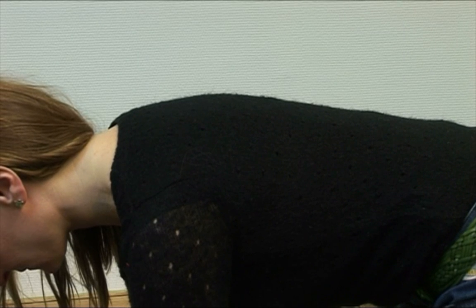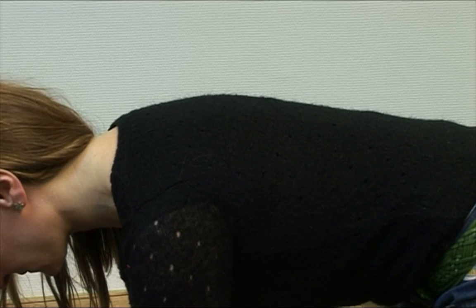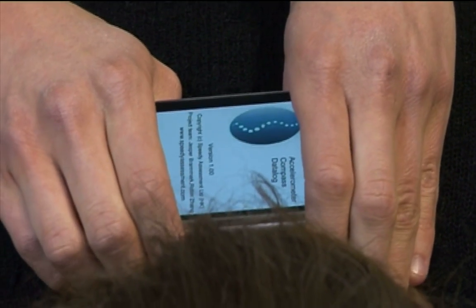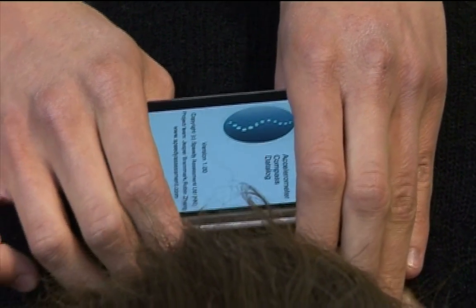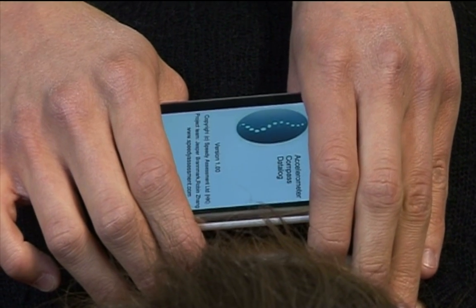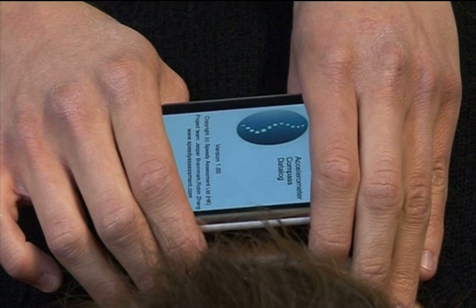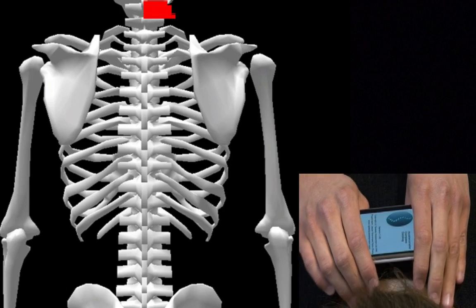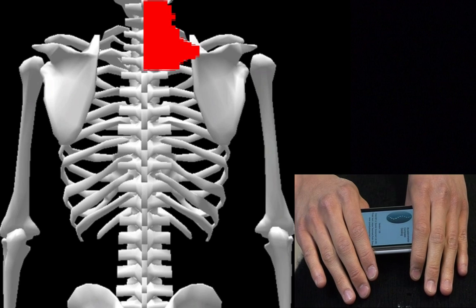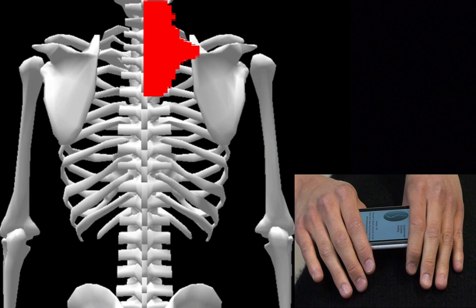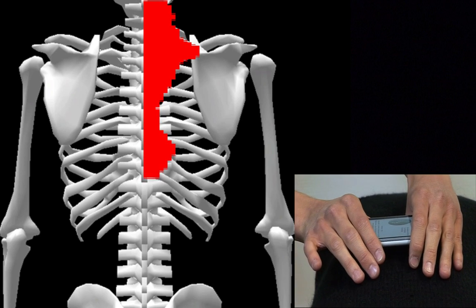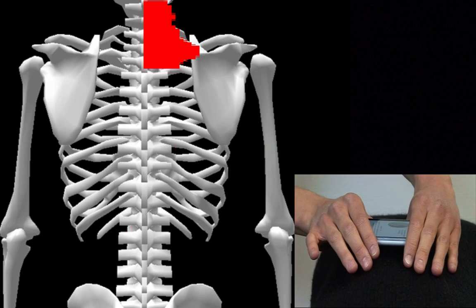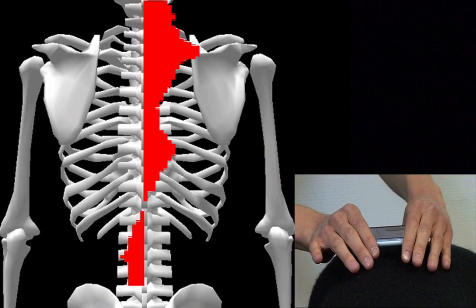Now you'll begin screening the spine. Hold your iPhone with the top of the phone pointing to your left, with two thumbs under it and in contact with the paraspinal muscles of C7. You have 10 seconds to draw the iPhone down the back until you reach the lower back and sacrum.